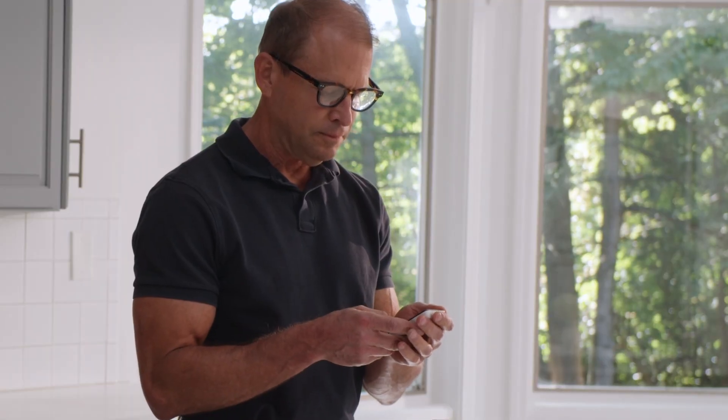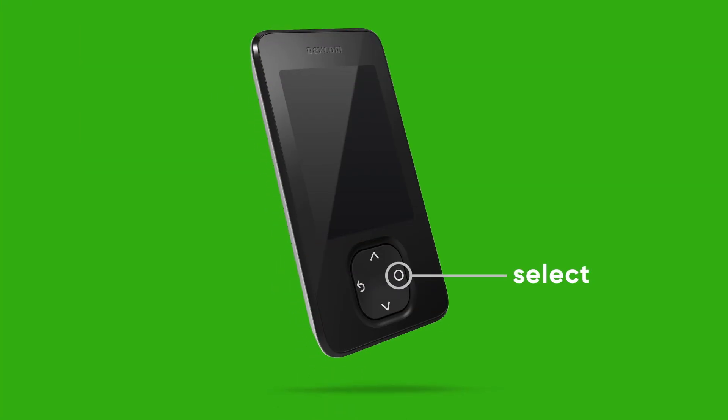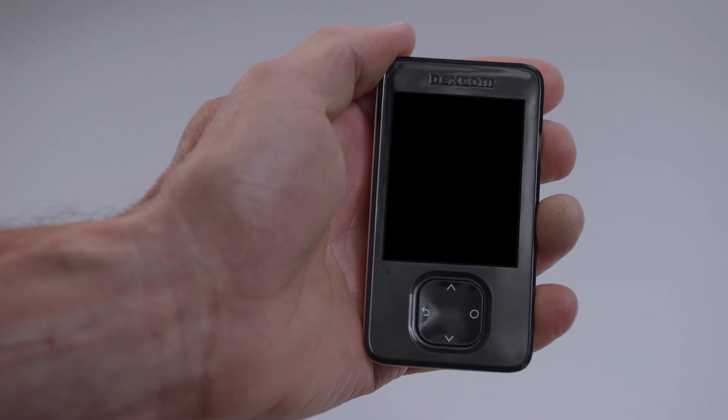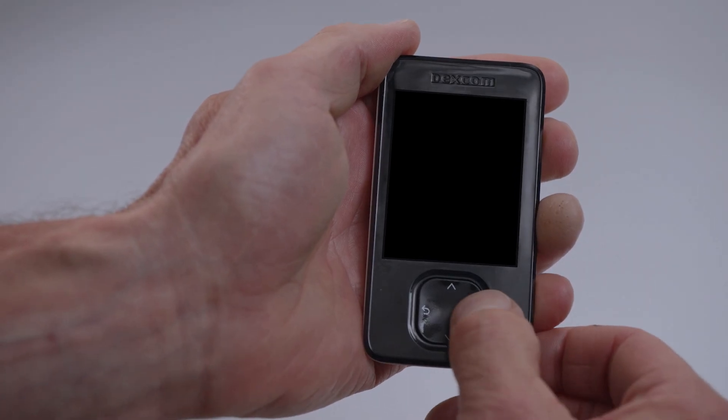Your receiver has four buttons: Select, scroll down, go back, and scroll up. To turn on your receiver, press and hold the select button for three seconds.